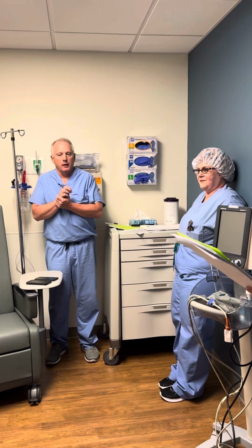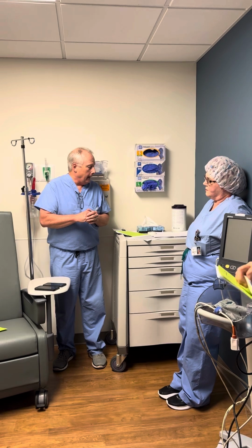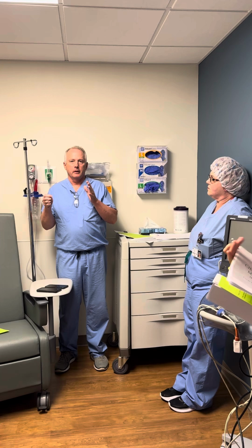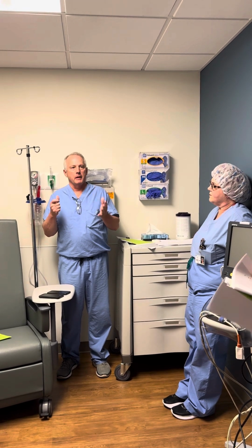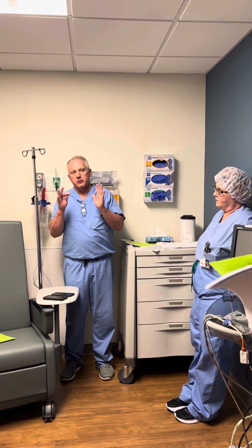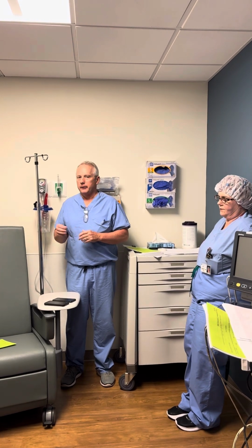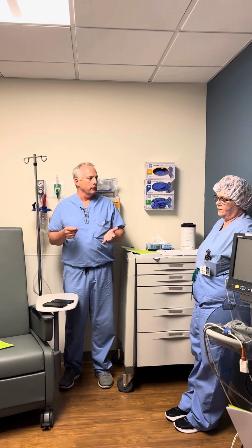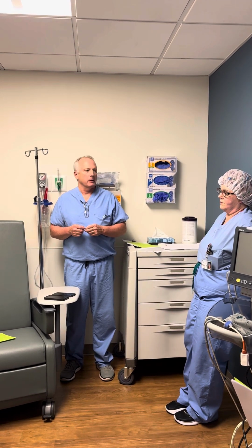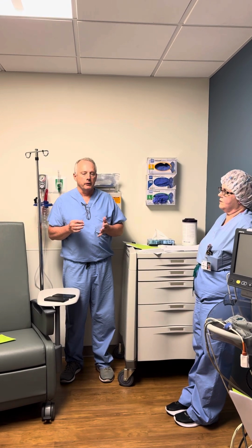Yes, you know. So my name's Ned Orth. I'm with one of the CRM companies, Biotronik, and just to expound on what you've been told, most of the time the cardiologist's office has already been engaged by the surgeon's office, and they're supposed to fill out a form, and that's supposed to come in on a sheet. I'm sure you've all seen it. So it's really all about the communication there and making sure everything's clear. Most of the time the cardiologist's office calls us, the reps, because they don't really know exactly what the parameters should be or what the policy should be.